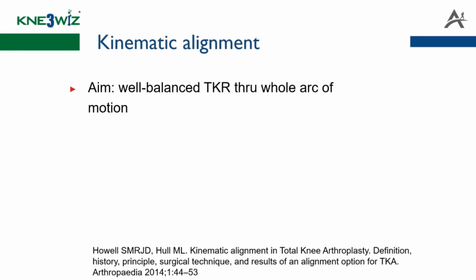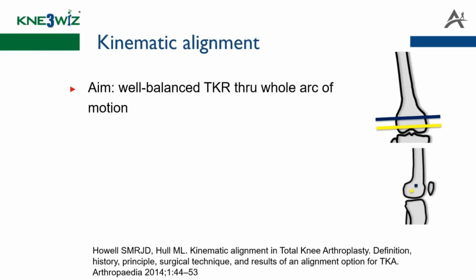Restoring to purely average normal anatomy or purely mechanical alignment may have ensured longevity, but function can be compromised. Hence, there was a need for an alignment to answer to the functional demands of the knee. The aim is a well-balanced TKR throughout the range of motion.